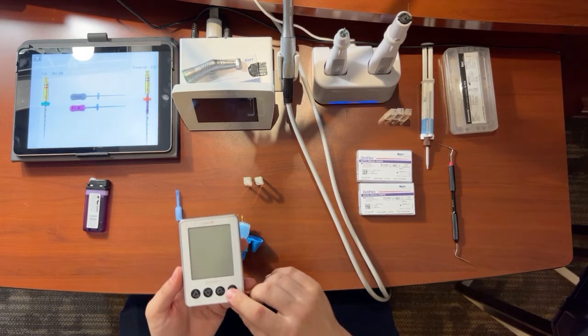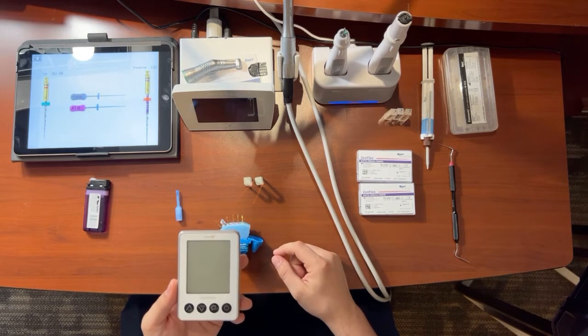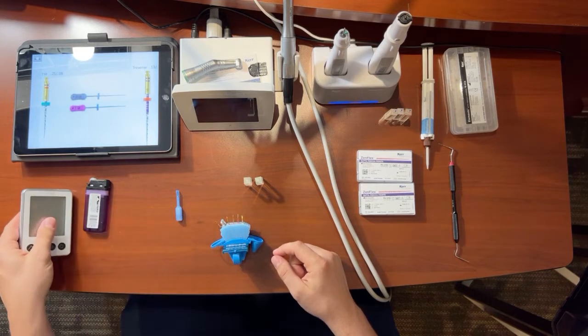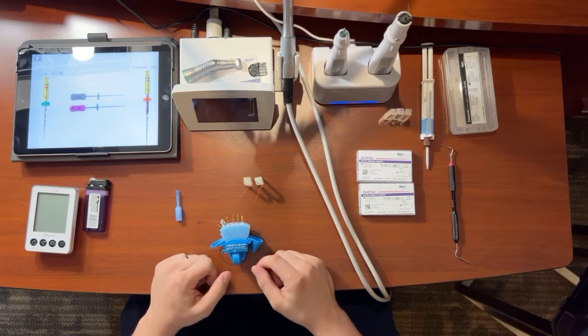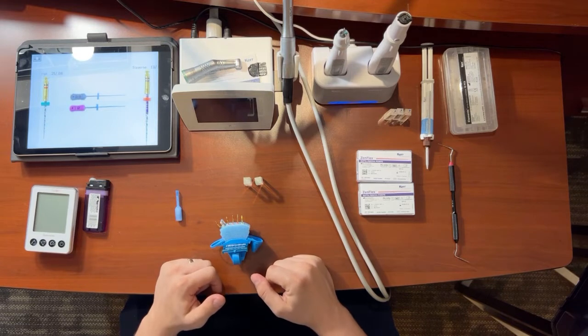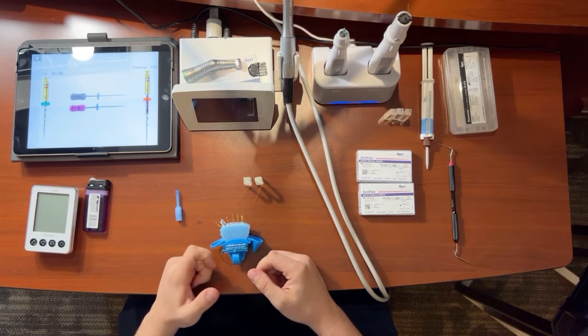So when it reads 0, 0, you are 0.5 millimeter away from the apex. It's nice to have that already pre-calibrated. Great apex locator. After you have established your working length, let's say it's 21 millimeters, then you're going to need to start doing your glide path.